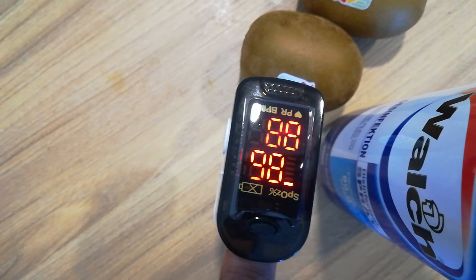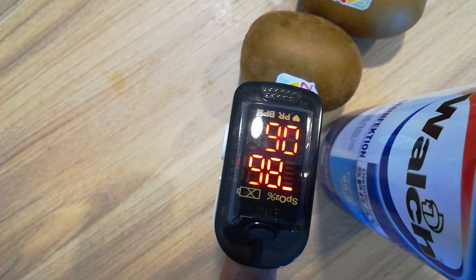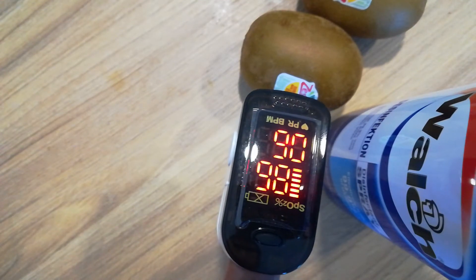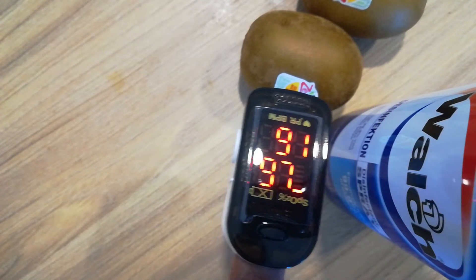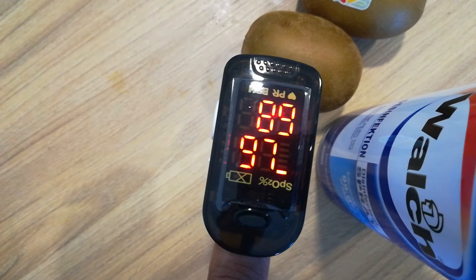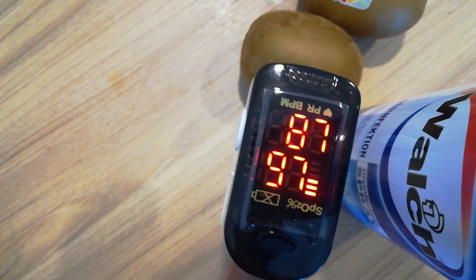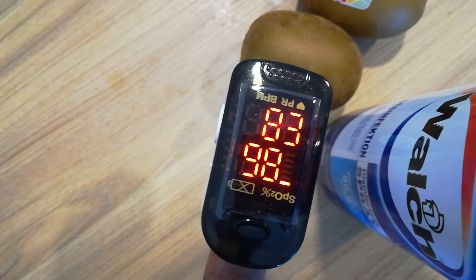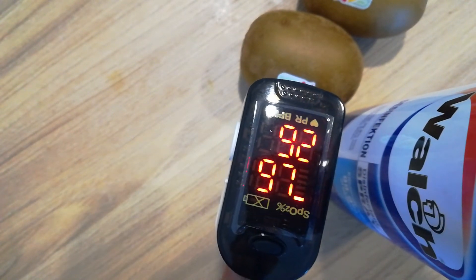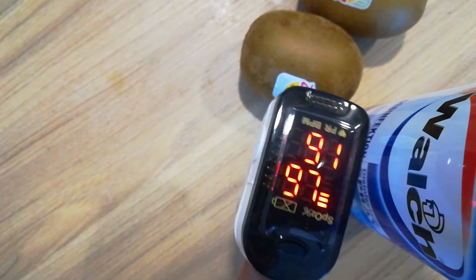The heart rate will slowly come down to around 72, 74, 77. If you have tension or you have just done running or exercise, the reading will not be the same — it will be different. So this is very important: SpO2 normal is 95 to 100.